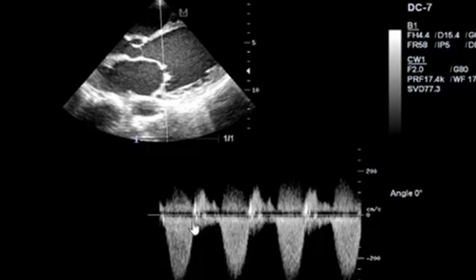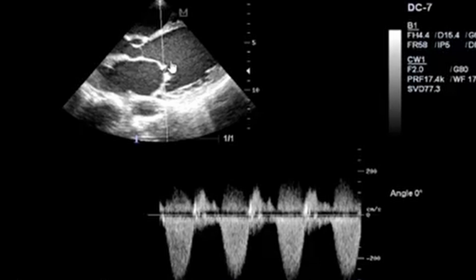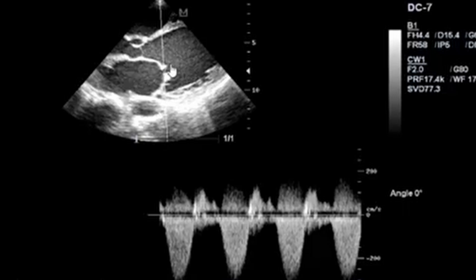The waveform is showing severe mitral regurgitation. Blood is actually flowing back from the left ventricle back into the atrium — this is what we call regurgitation. This is just a case showing basic echocardiography, demonstrating blood flowing back from the ventricle into the atrium, a condition called regurgitation — a case of valvular disease.